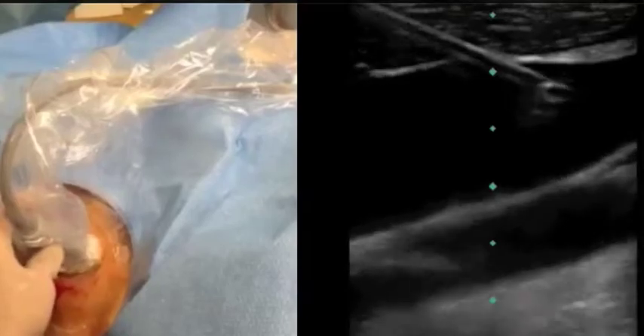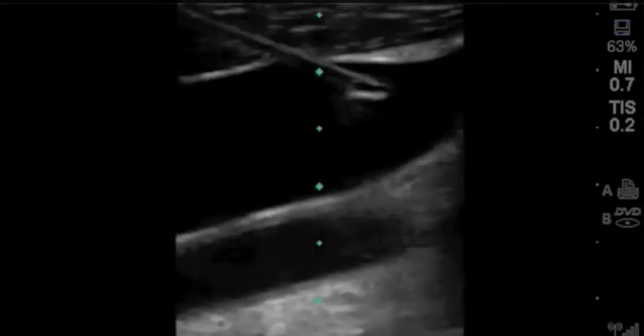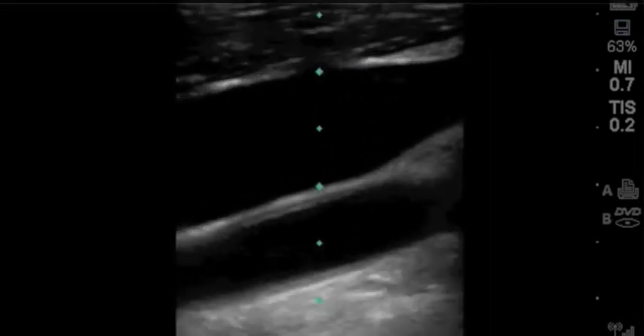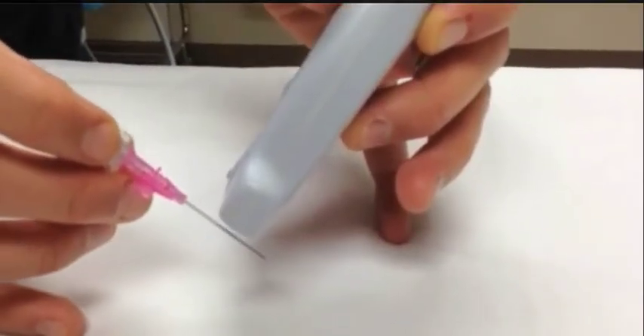If you are not sure of the location of the needle tip, you may turn the probe 90 degrees to visualize it better. The entire procedure can be performed in this orientation as well. It can be difficult as the probe, needle, and vessel all must be lined up perfectly. The ultrasound beam is 1mm thick, and this can be technically difficult, but many physicians prefer this long axis approach as it is easier to visualize the tip of the needle. You don't have to worry about seeing a posterior portion of the needle when the tip is actually deeper in the patient, as could happen with the short axis approach.